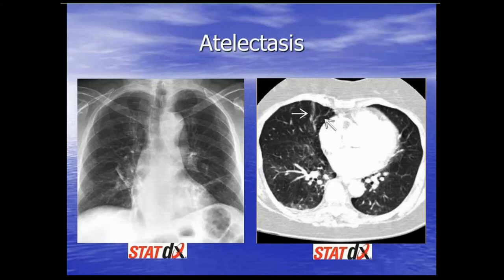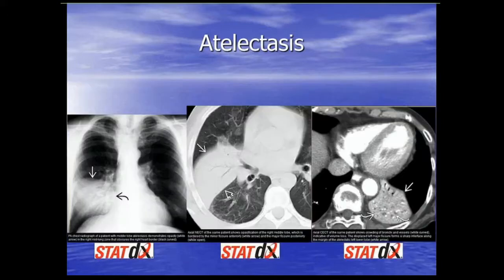This is a nice case of atelectasis, which we see all the time. This is sub-segmental or plate-like atelectasis. These more difficult cases of atelectasis can look like pneumonia — significant opacity with air bronchograms that looks like a consolidation.